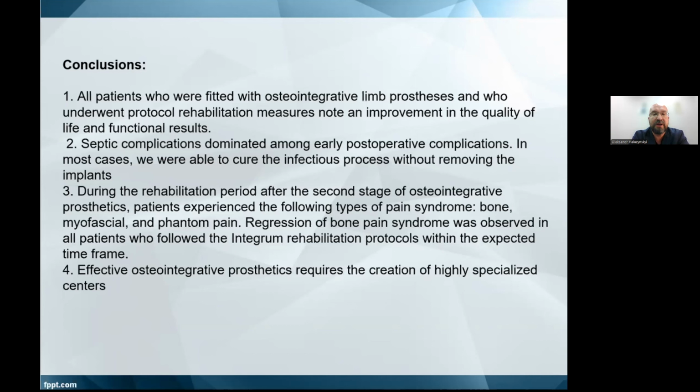During the rehabilitation period after the second stage of osseointegrated prosthetics, patients experienced the following types of pain syndrome: bone, myofascial, and phantom pain. Regression of bone pain syndrome was observed in all patients who followed the Integrum rehabilitation protocols within the expected time frame. Effective osseointegrated prosthetics requires the creation of highly specialized centers.